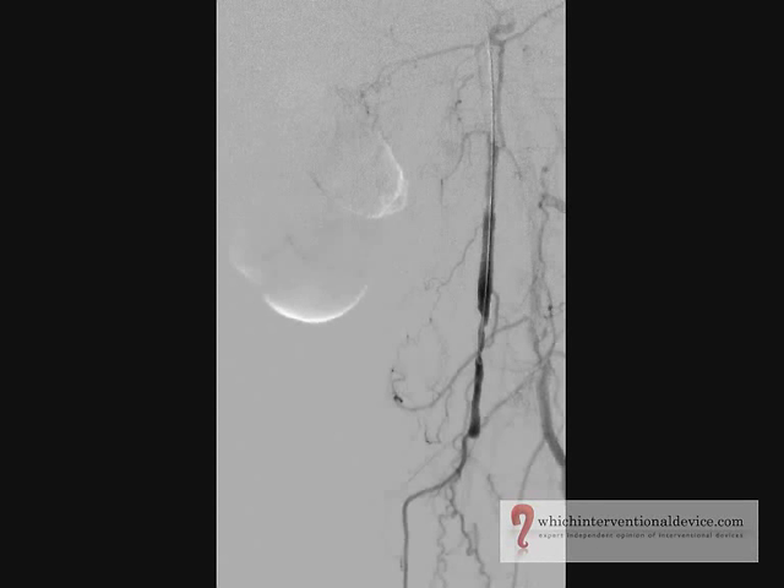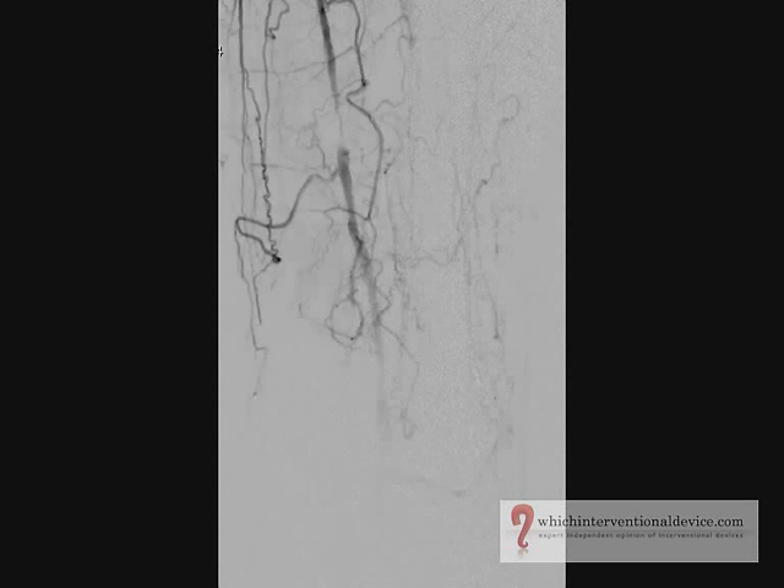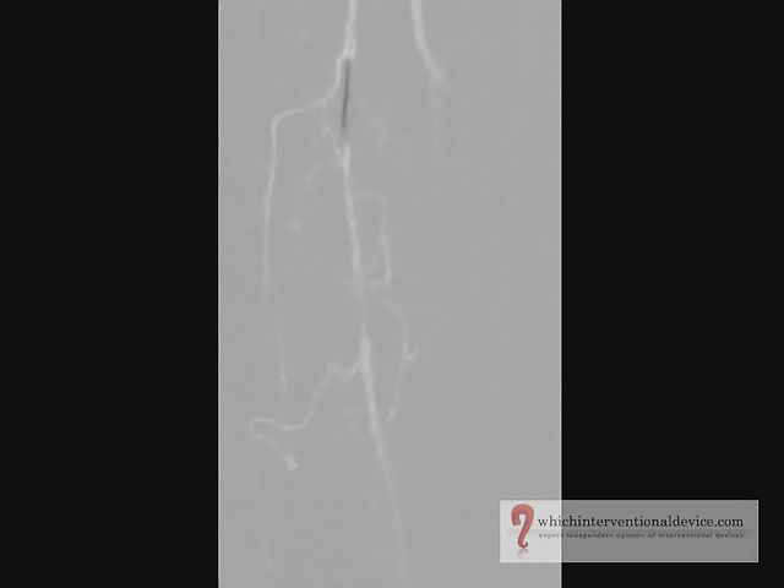Angiography demonstrates some irregular stenosis in the SFA with a short occlusion more distally. Towards the adductor hiatus there is a further significant stenosis with collaterals around it.